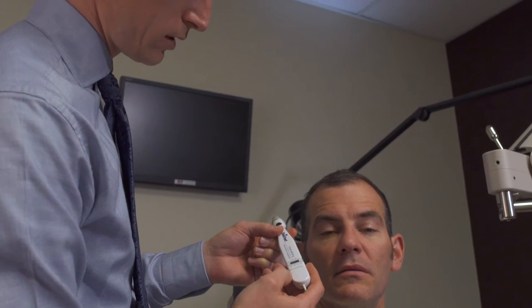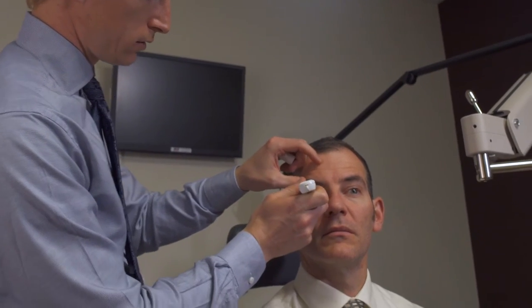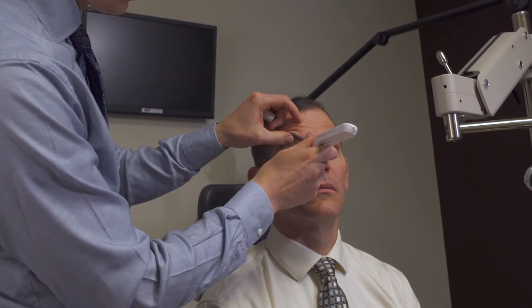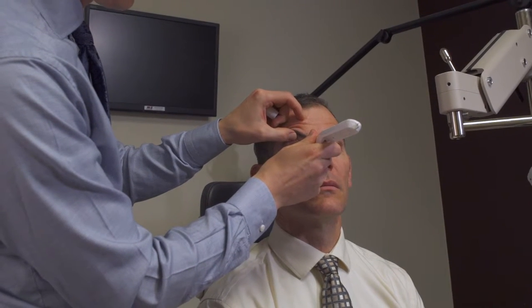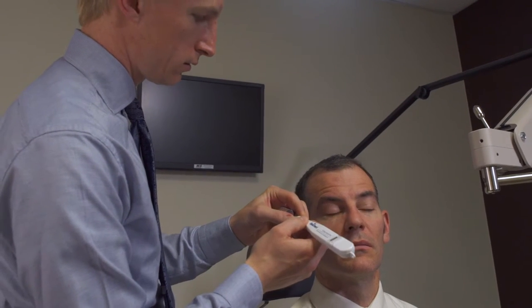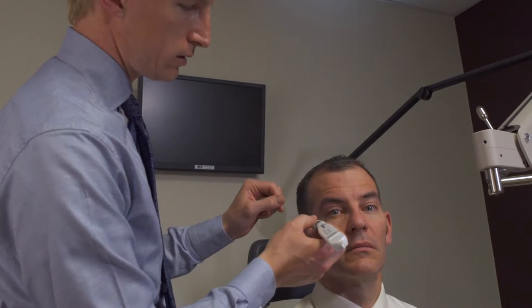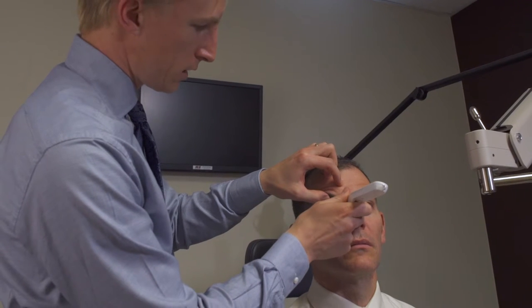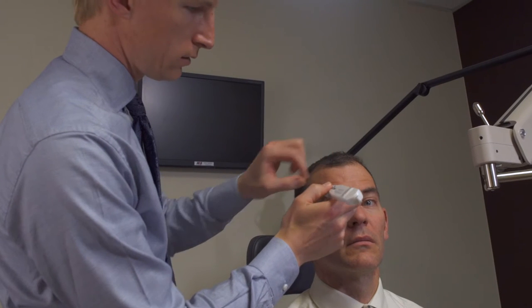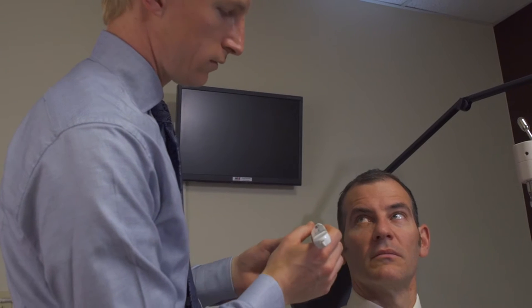To repeat, simply push the button again to get back to the two dashed lines. Have the patient looking straight ahead, lightly tapping at the central cornea. If you do not hear the auditory feedback, check to make sure that the tip covering the Tonopen is properly seated. Re-push to get back to the double dashed line, and after a few taps we get a pressure measurement of 10 with a 5% error.